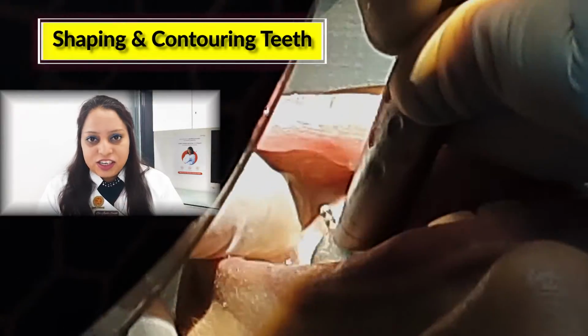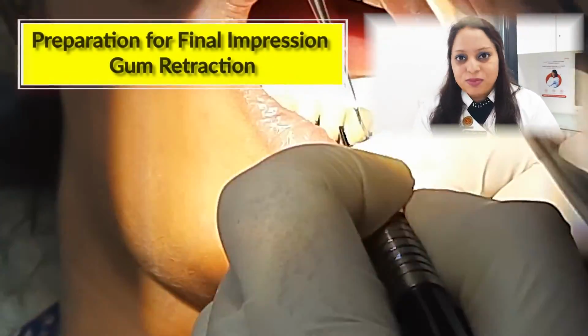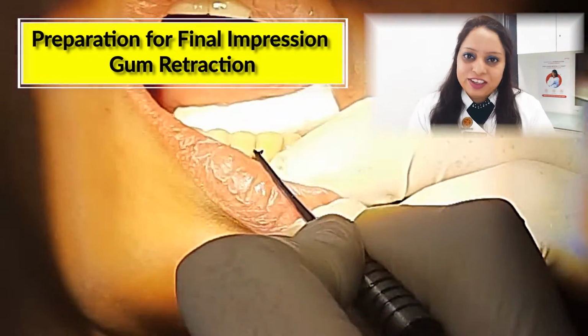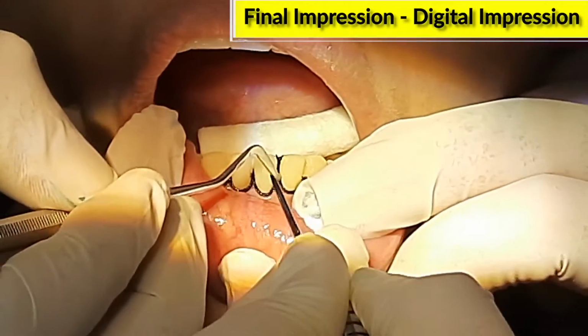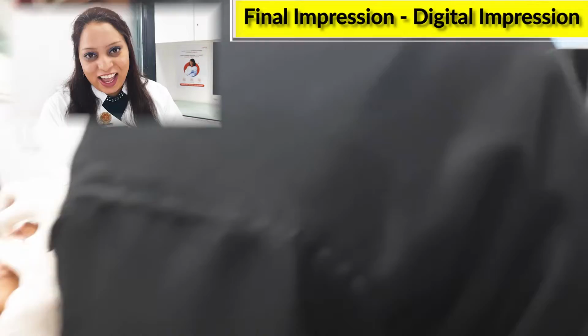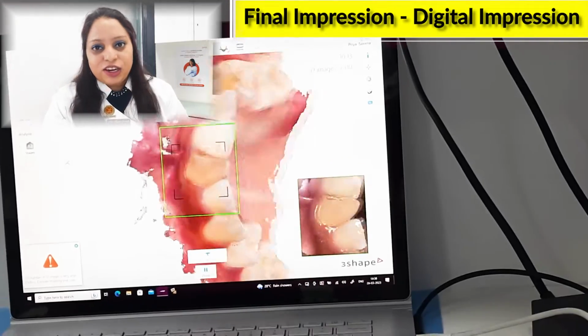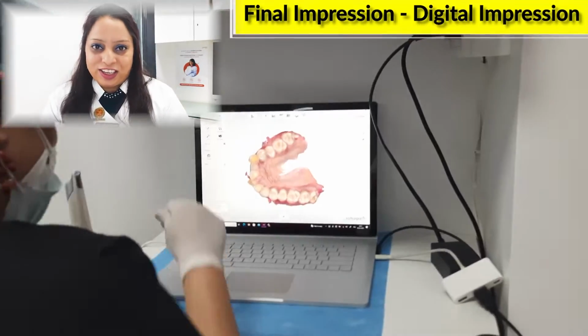After teeth preparation is done, the next step is to record the digital scan. But before that, gums can interfere. So to deflect the gums away, we use a chemical and a special thread. That's the digital impression. This is being done using an oral scanner. This digital scan is converted into an impression and a digital file is sent to the lab for fabrication.